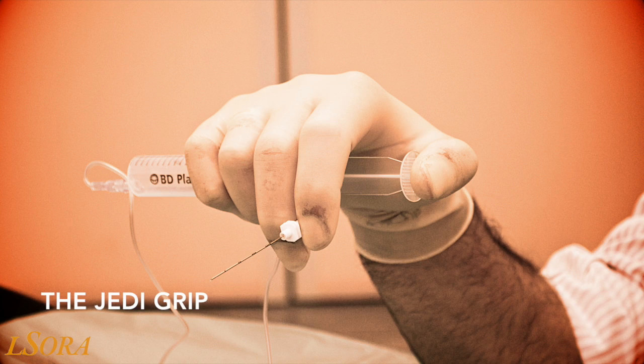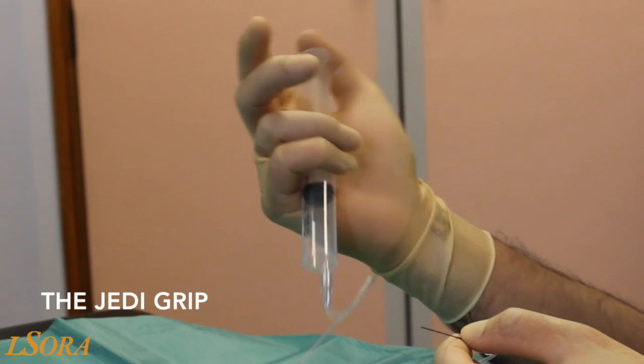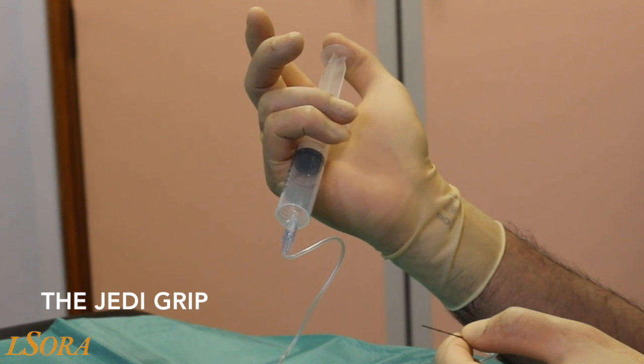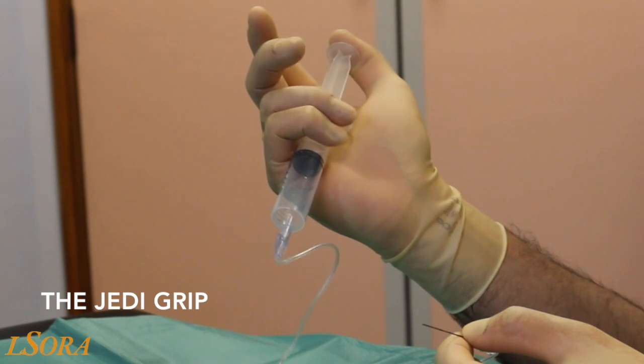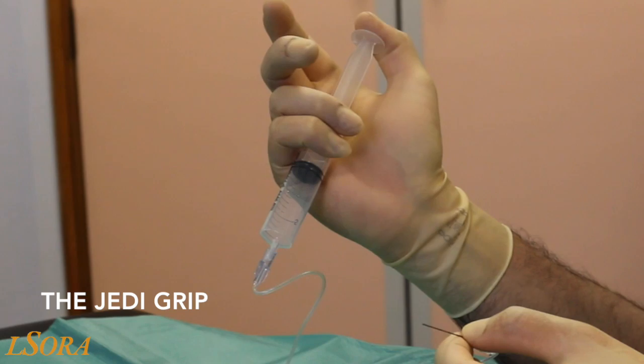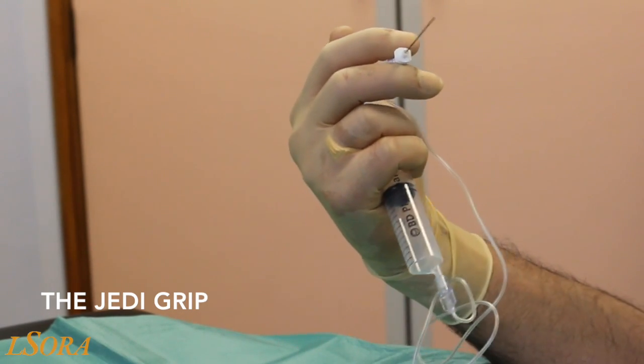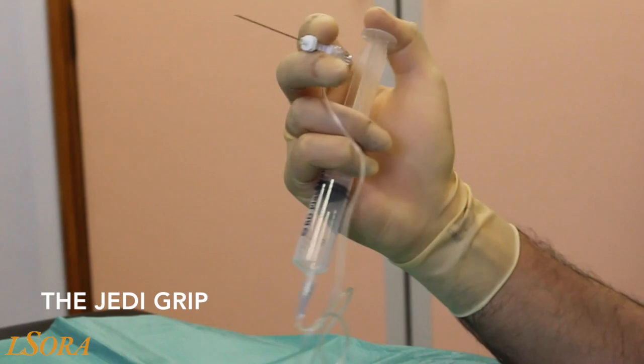The second technique demonstrated is the Jedi grip, described by Drs. Pappin and Christy from Derriford Hospital in Plymouth, UK. With the Jedi grip, the syringe is once again placed beveled down and held in the palm of the hand between the little and the ring finger. The thumb is placed on the plunger.